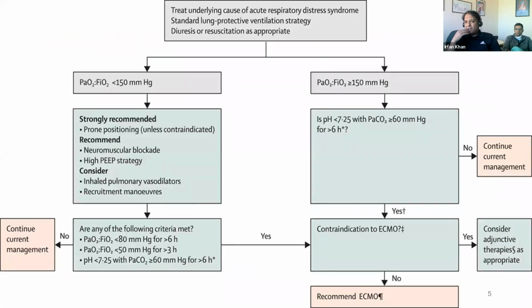Anytime you have a therapy that you're offering, since it's a very complicated therapy fraught with complications and obviously high cost, you want to make sure that the patient has met criteria for the therapy. Otherwise, it becomes too chaotic. Patients who may not need it are getting offered this treatment. So based on that, this is essentially an algorithm that's followed by most places.